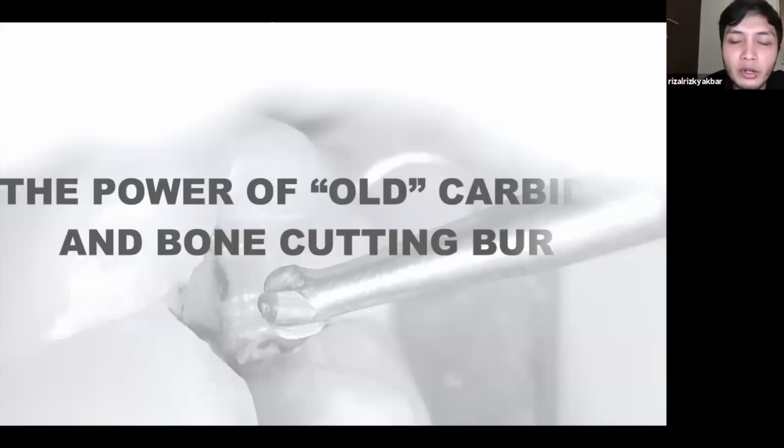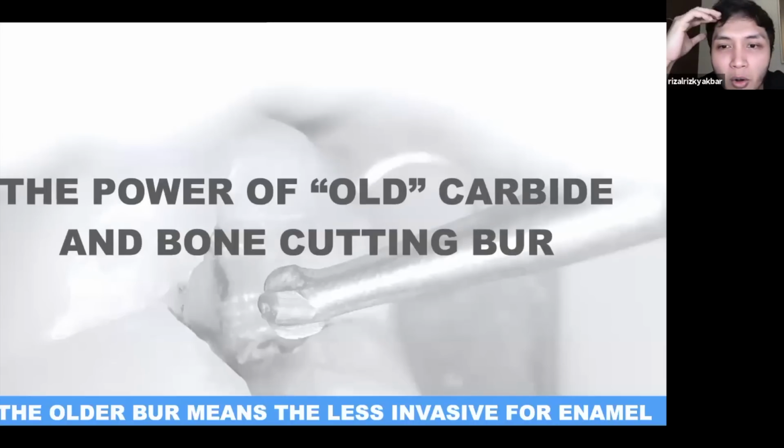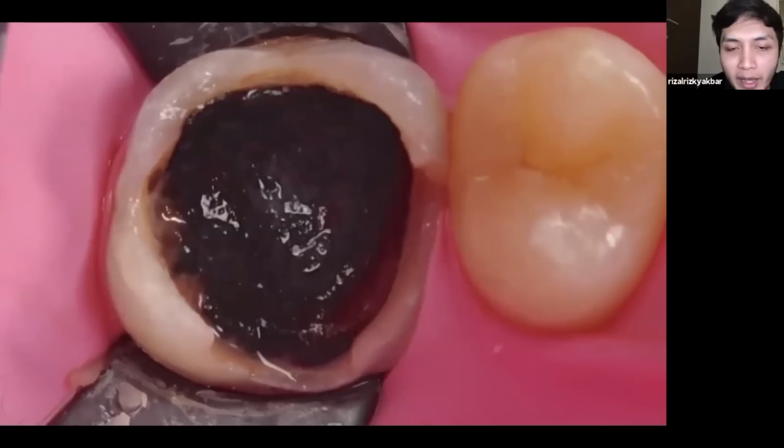And I would like to introduce you to the old carbide and the bone cutting burr. The old carbide and the bone cutting burr are really helpful for cases like replacing an amalgam filling or for cutting affected and infected dentin, especially the infected dentin. But I use the old one. The older one means you have already used it like 5 or 6 times. So don't throw it away. Save it, and you can use it for cutting the infected dentin or cutting the amalgam, because it will be less invasive for the enamel.